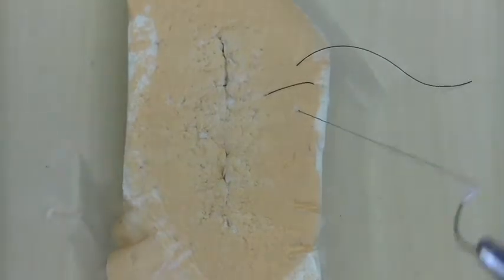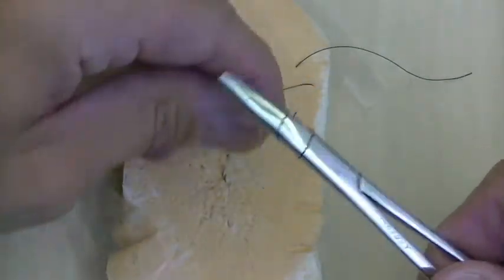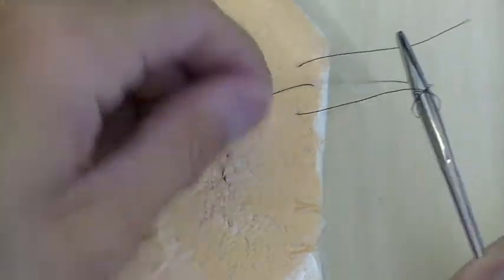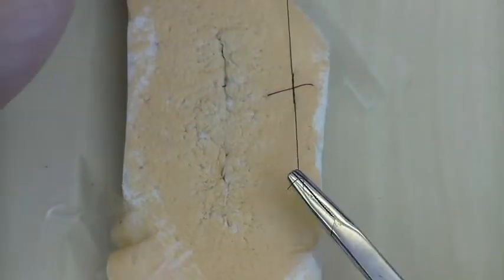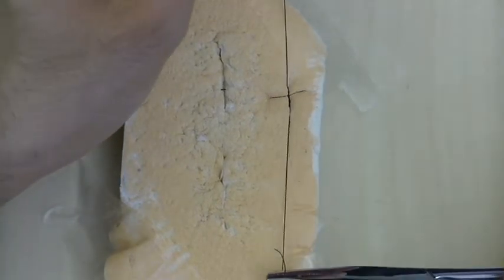The reason it's called a figure-of-eight stitch is because when you tie it down — and you're definitely going to want to do either a surgeon's knot with instrument tie, or if you're doing a two-hand tie that would be even better — it looks like an X or kind of a figure of eight.